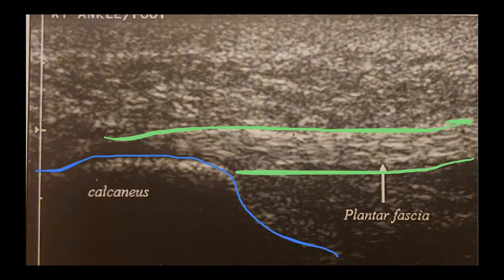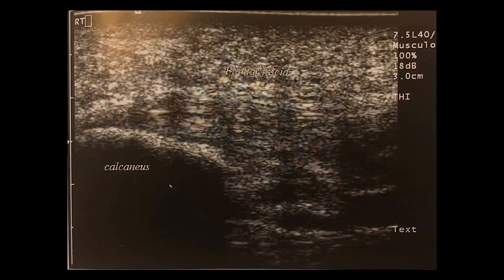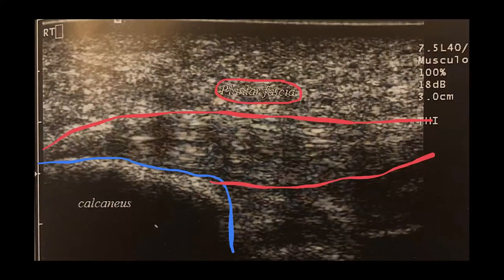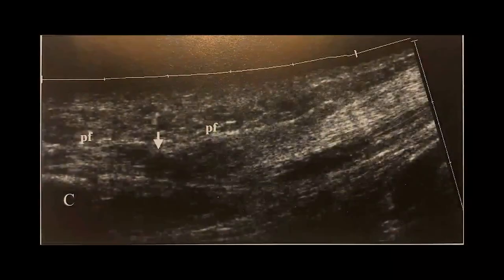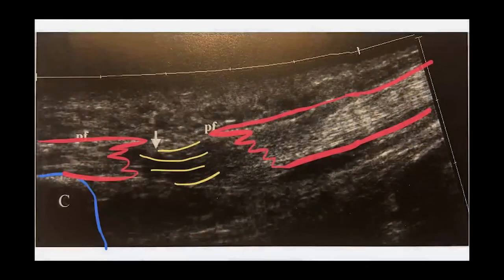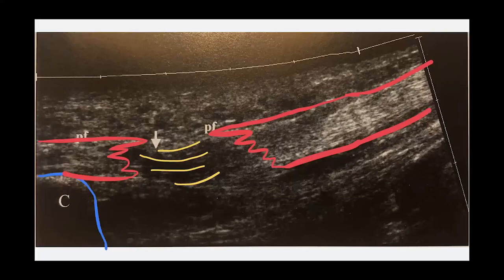Normally the plantar fascia is of uniform thickness, typically measuring about 4 millimeters, and the plantar aspect of the calcaneus is normally smooth with a rounded margin as seen here. In this longitudinal image demonstrating mild plantar fasciitis, there is thickening and decreased echogenicity of the plantar fascia at the calcaneus. Note the presence of a small spur along the base of the calcaneus as well. Blind cortisone injections can result in interfascial deposition and have been associated with plantar fascial rupture. In this longitudinal extended field-of-view image, you can see a complete rupture of the plantar fascia as noted by the arrow. Thank you guys for watching — hope you learned something until next time.